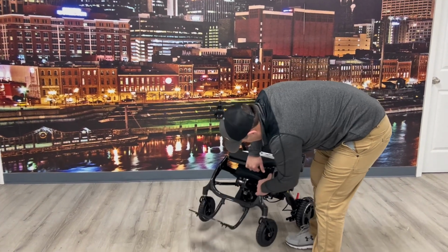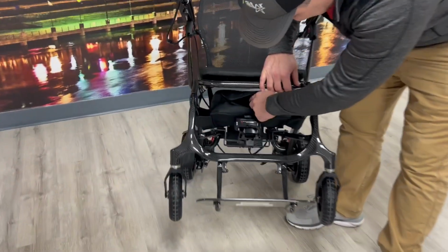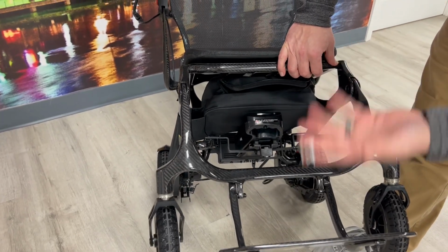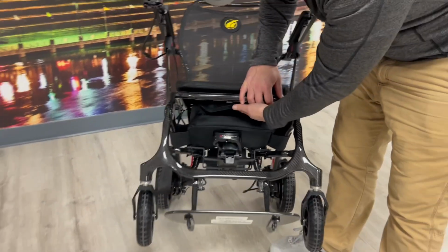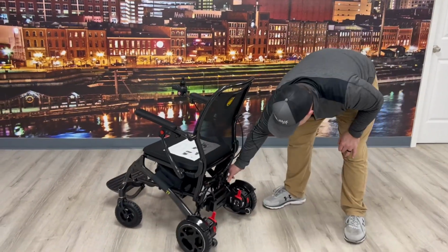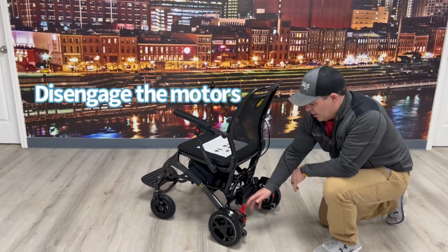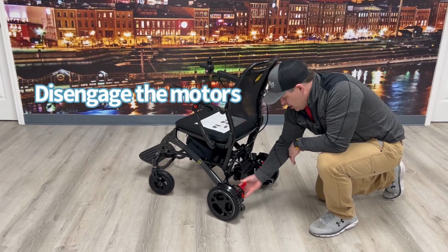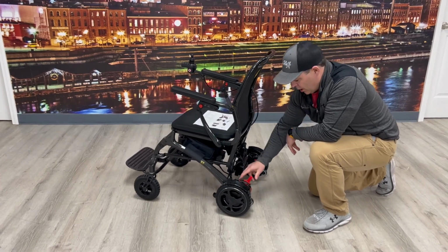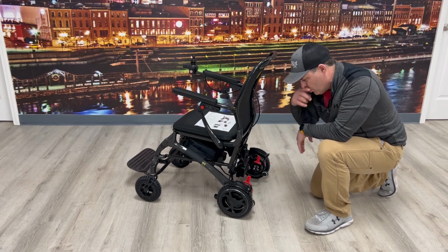It does have a compartment under here, a little storage area, a little bag that is hooked there. I wouldn't say it's the most convenient thing, but it is handy if you were putting something in here. It has a zipper pouch that you can deal with. It comes with a seat belt as well that's standard with it. Just like most of your power chairs, you can disengage the motor, so you could push it if the battery went out and just engage back. It even shows it on the side of the motors how to do it and what goes where.